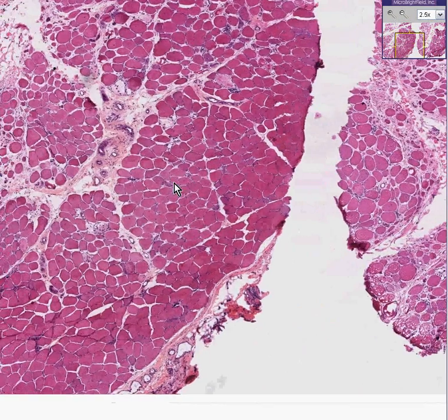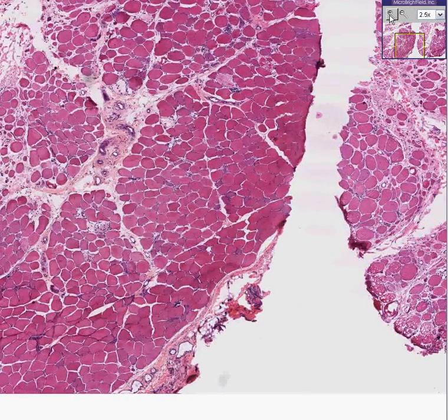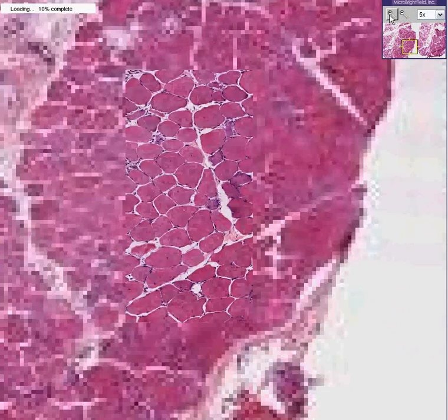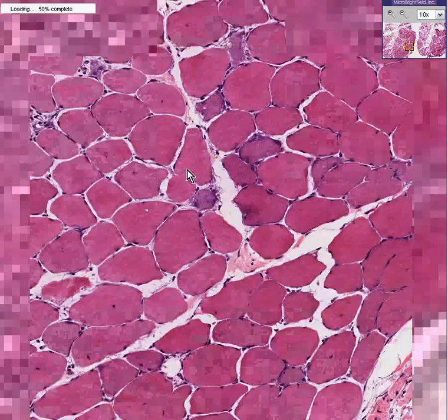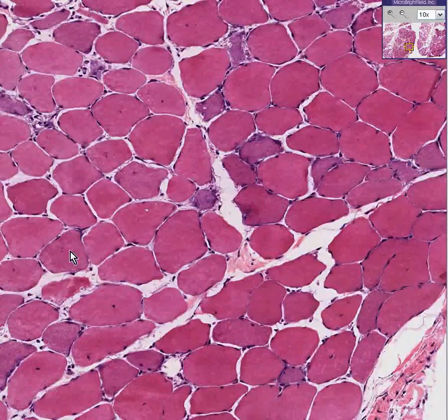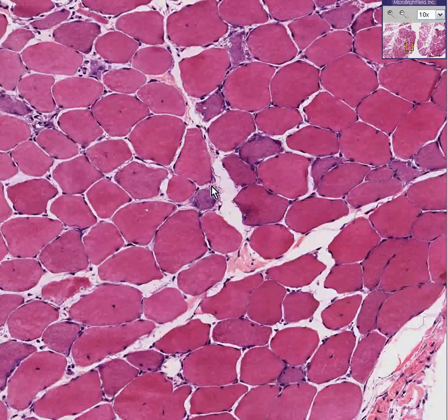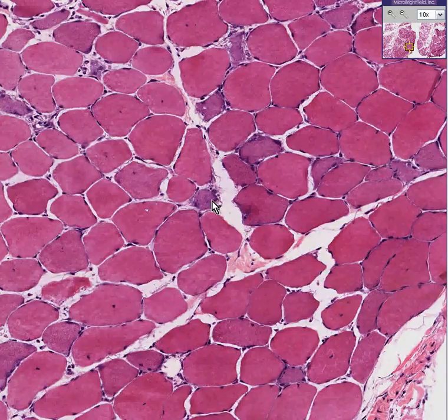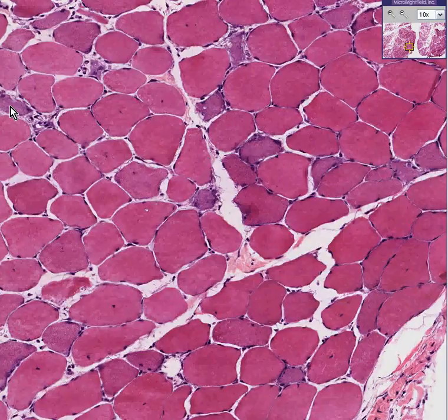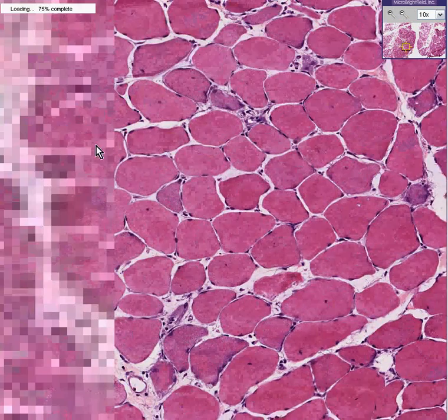Let's look at one of the more normal-type areas. They're relatively uniform in size and you can see the nuclei at the periphery. But you can see occasionally — here, and here, and here — that some of the fibers are not taking up the stain nicely and they're not as big as they should be. This is the more normal area.